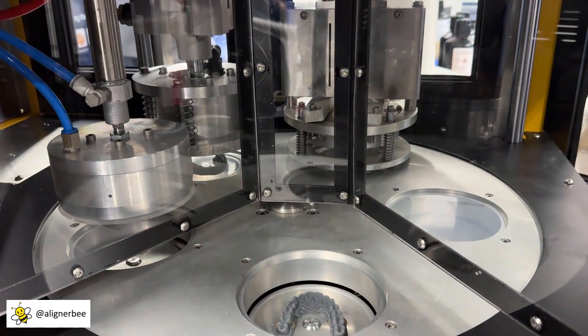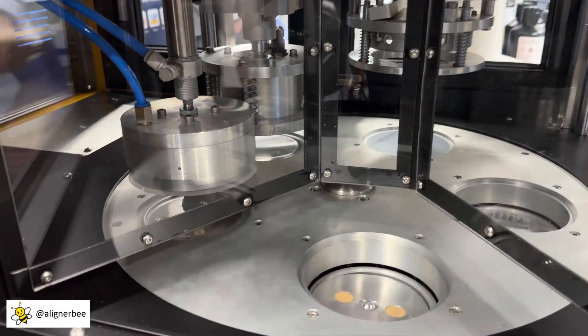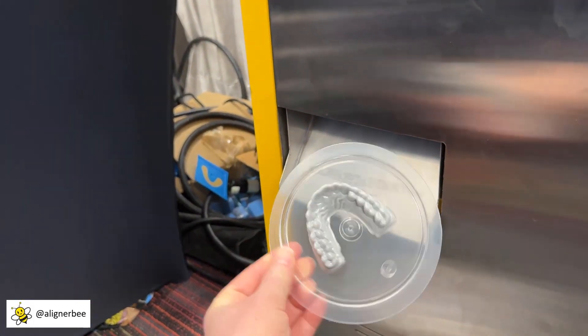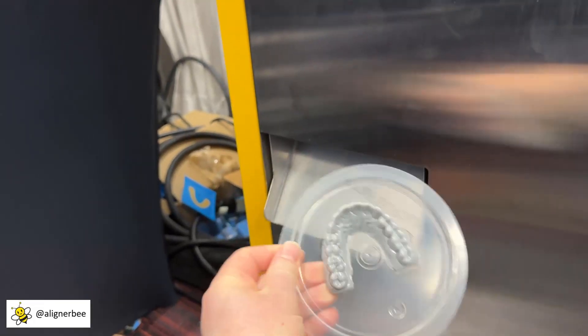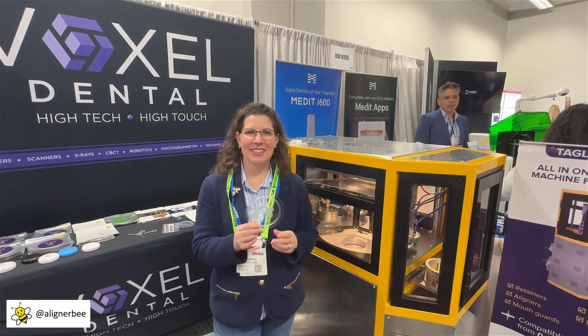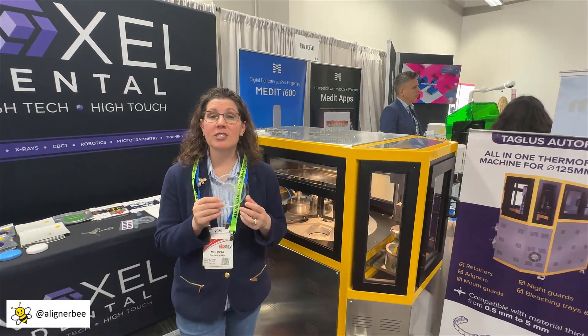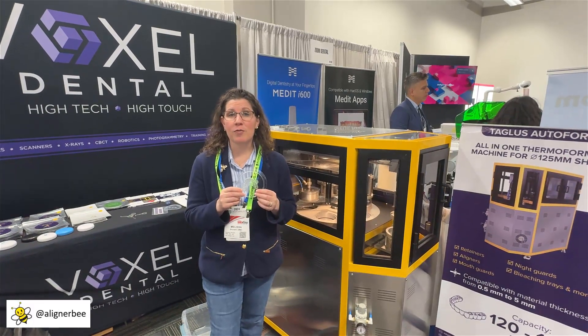So now that will be picked up and it will drop here. We can see the quality of the positive pressure thermoforming unit, giving us a beautifully clear aligner in an automated fashion that can reduce the time that a technician spends utilizing a single vacuum form.